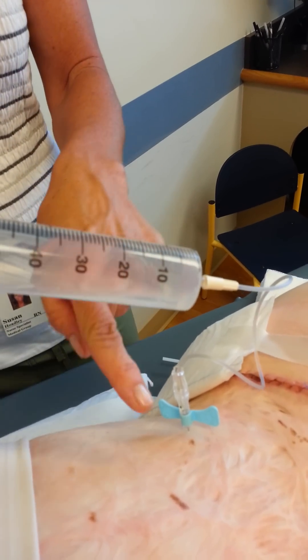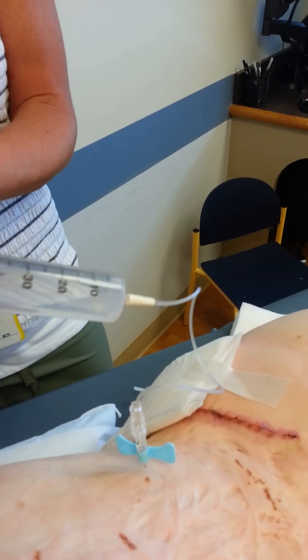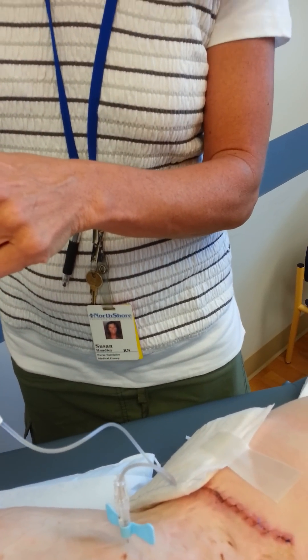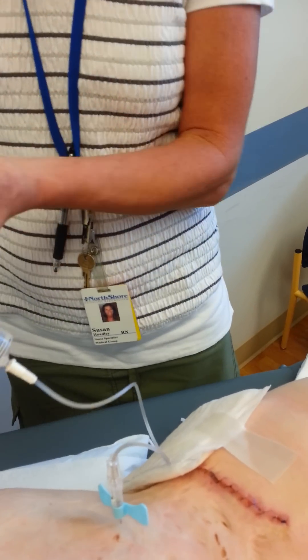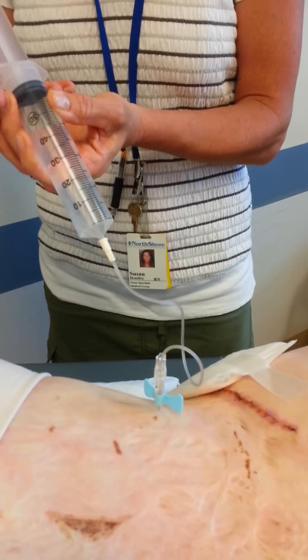If you weren't in the port, it would look yellow-tinged or red-bloody-tinged. But we're in there. I could go past that 60 — if I had another empty syringe, pull 60 out, because there's already 120 in here. Clearly we're in it. It's pulling, pushing in, pulling out really easily.